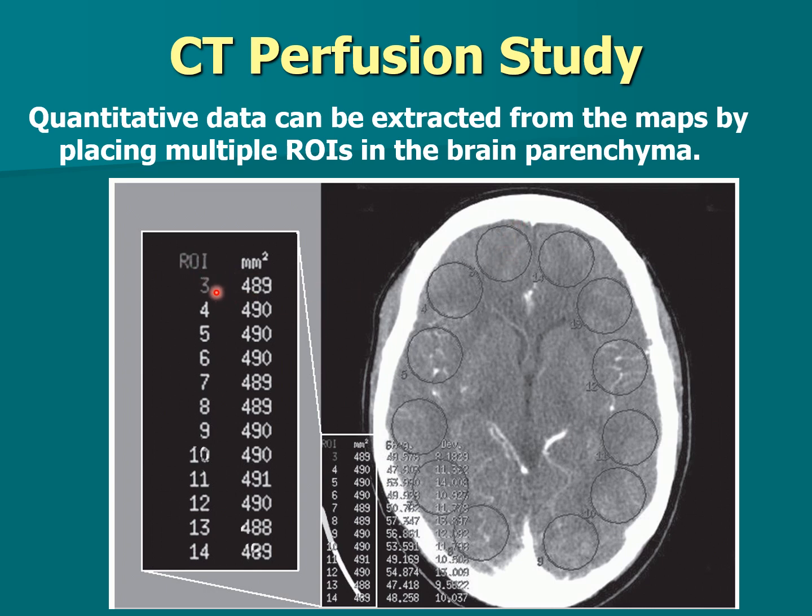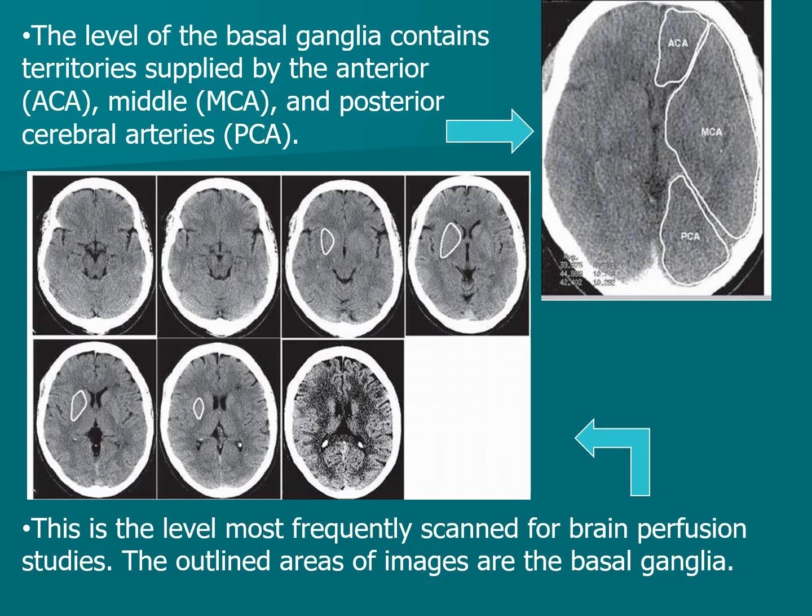So they're looking at these ROIs. The CT numbers are about the same. This is the ROI, and this is the number that we're given. The size of these is about the same, and then it would give a reading of what the CT number is on each one of these. And if one of these is greatly reduced or much greater than another area, we could say that it is being perfused differently. So perfusion is just looking at how well the blood flow is to the brain.